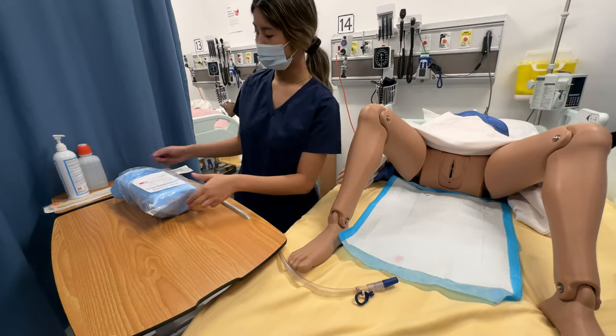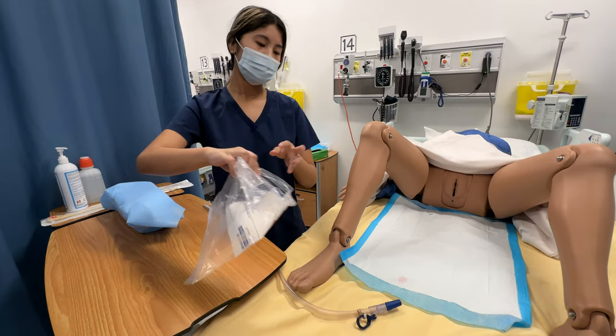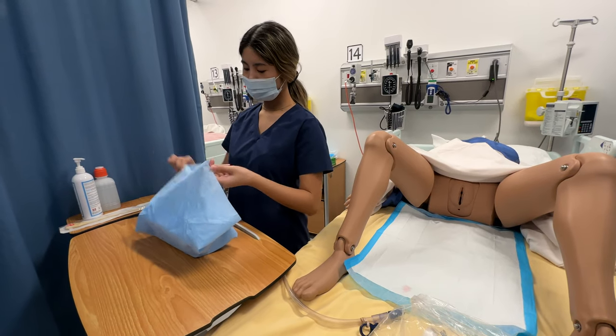Once that's done, I'm going to prepare my sterile field. I'm going to keep my garbage nearby. I'll make sure my table is at an appropriate height. I'm going to prepare my sterile field, opening it away from me.